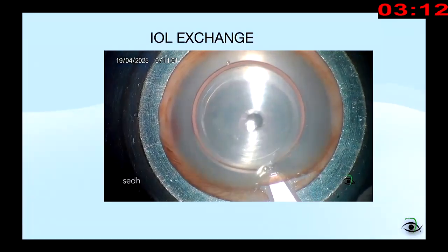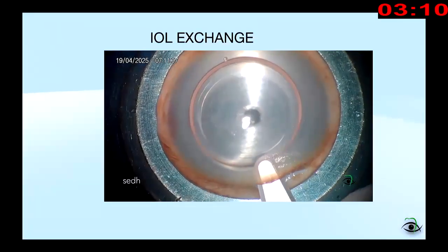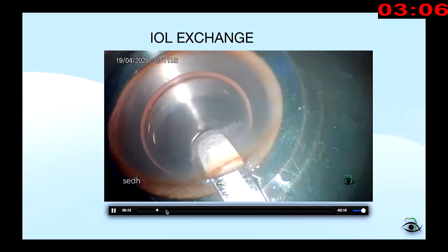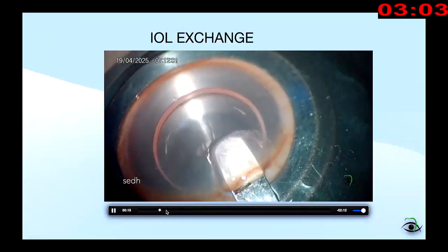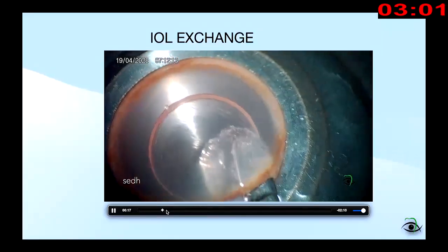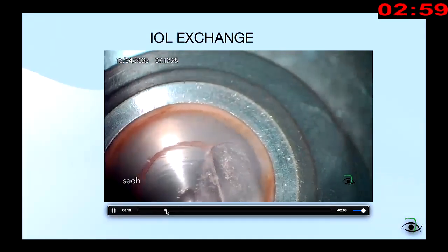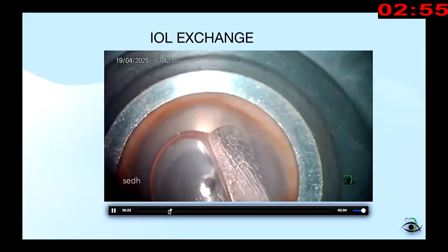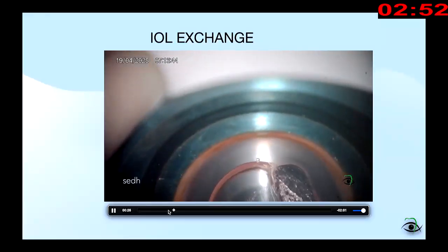So mind it, it's our manual dissect. So as we go with the crescent and then the dissector, your desired depth, thinner the graft, better it is. Thicker the graft, easy to insert and place.